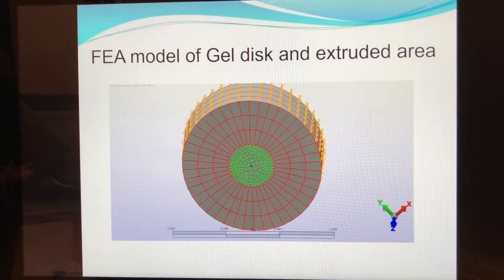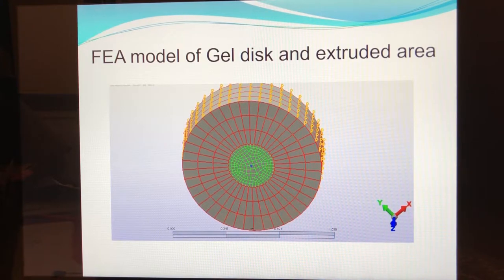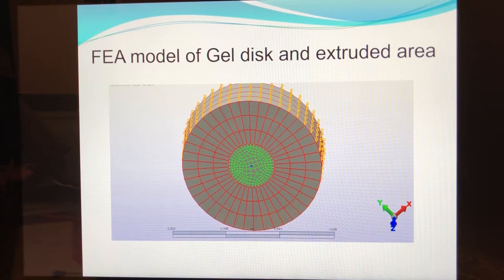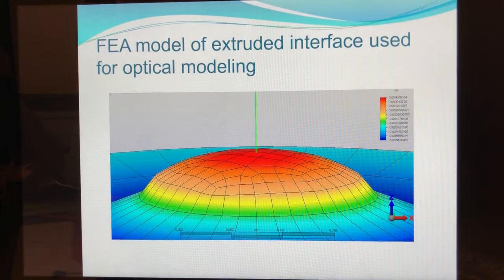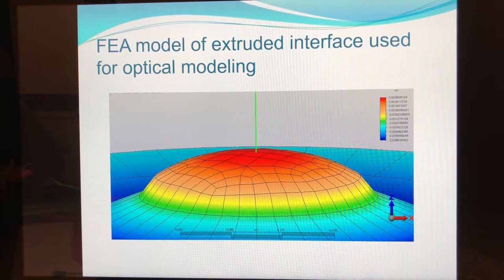We now have a concept, first-order design, and a best guess working prototype. Now we develop a mathematical model of the lens which will be verified by the prototype. Since the lens utilizes mechanical deformation, the model incorporates finite element analysis to produce a deformation of the accommodating refractive surface. The finite element analysis model provides us with a deformed refractive interface, shown here as having some oblate asphericity.